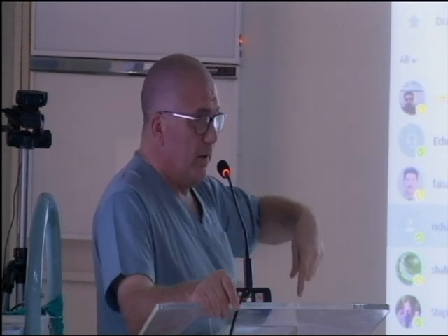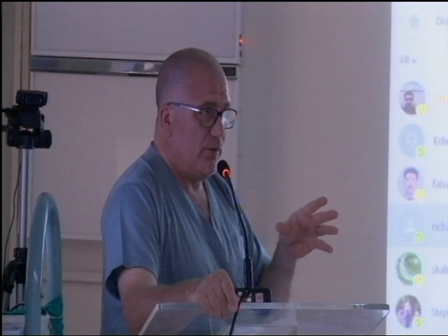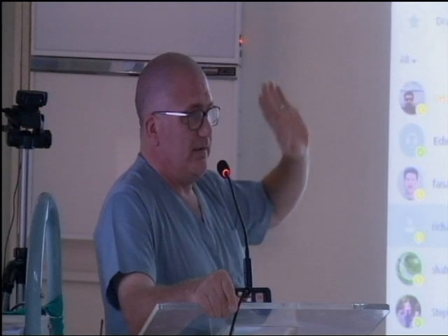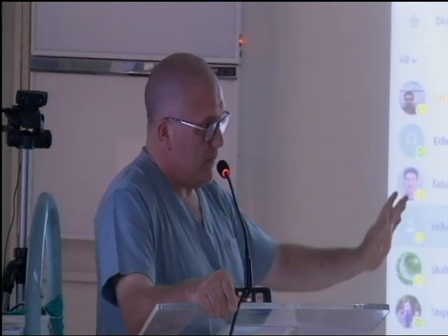Richard to come to that one is I had a feeling it wouldn't lift. So we were going to make a definitive treatment option. If I was unsure that it wouldn't lift, but I had an inkling that it was going to do something and I could have teased it out, I've got him stood next to me, I would have done it, and then we would have taken him straight to theatres. If the polyp didn't lift, which is what I felt it wouldn't do, then he's there as the surgeon to say, this is how we're going to manage it, and then we take him off.